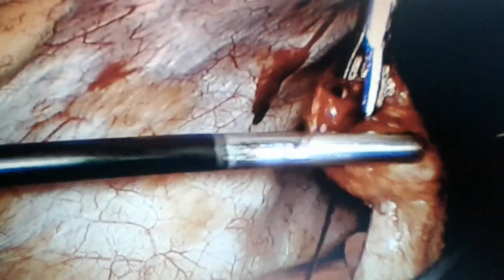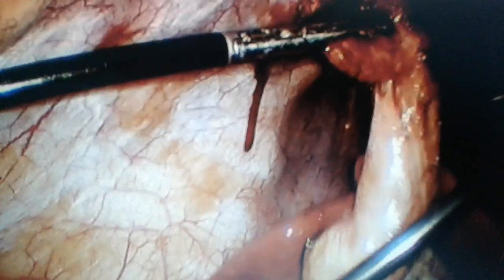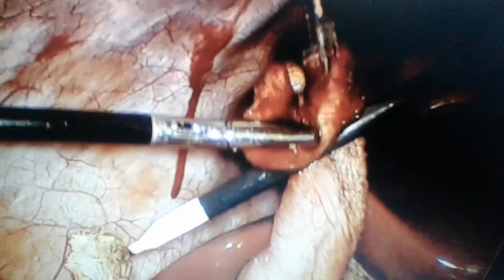So again, without pointing out the mistakes done by the assistant by loosely holding it, the surgeon again has asked the same assistant to hold on, and let's see what happens next.